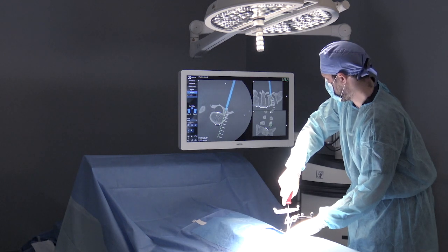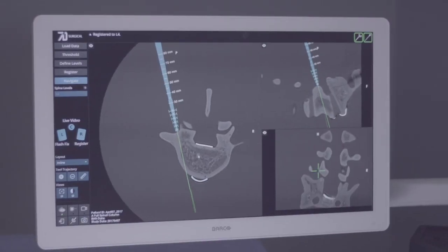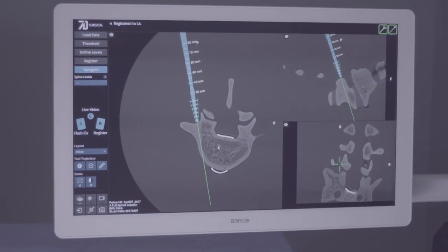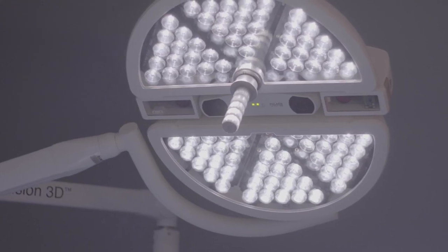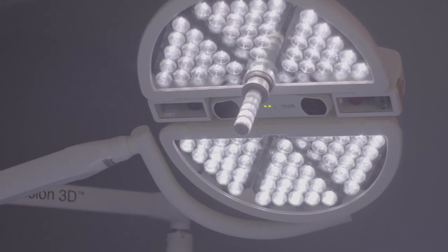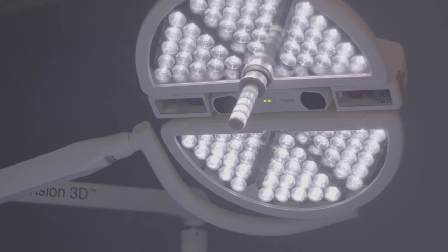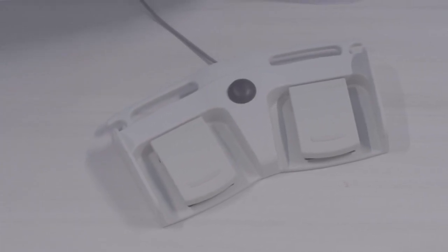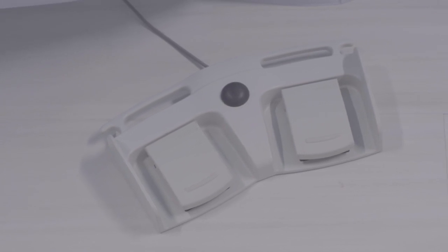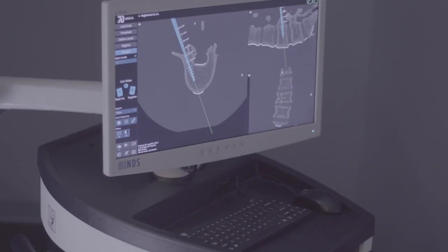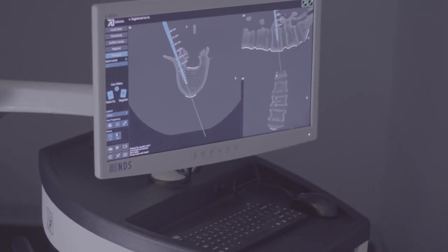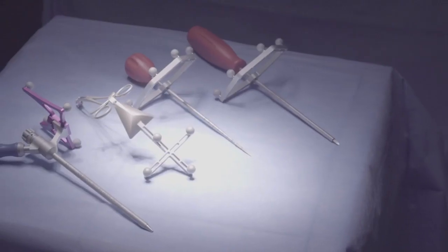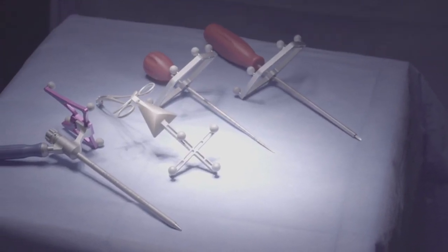Let's take a look at the major components of the system: the high definition surgeon display, the integrated surgical light with embedded machine vision camera technology, the foot pedal which provides sterile control of the necessary software functions, the non-sterile user station for pre-operative setup, and the pre-registered and tracked tools.